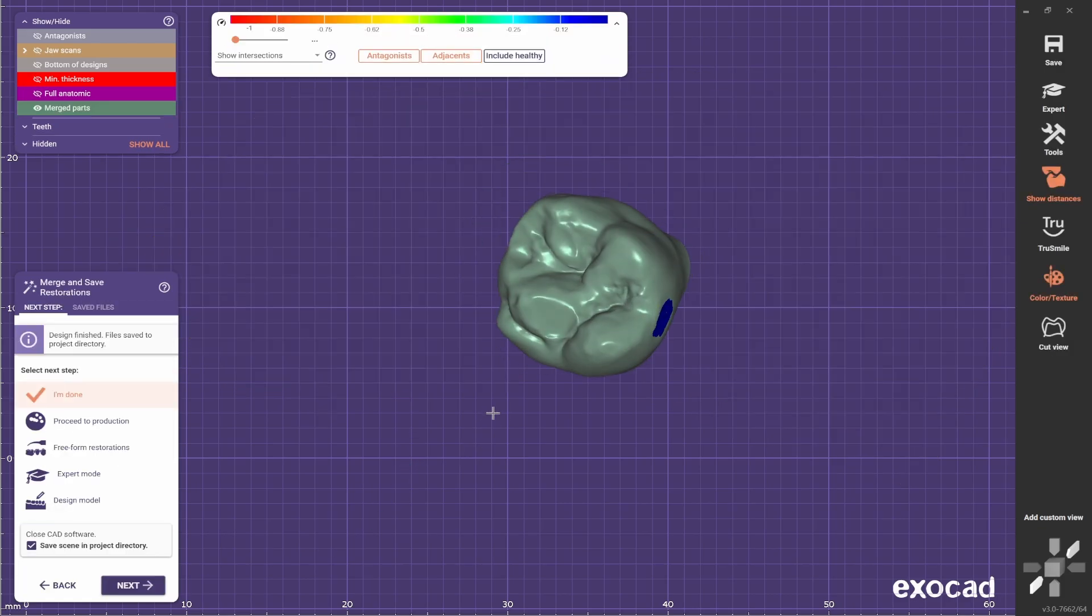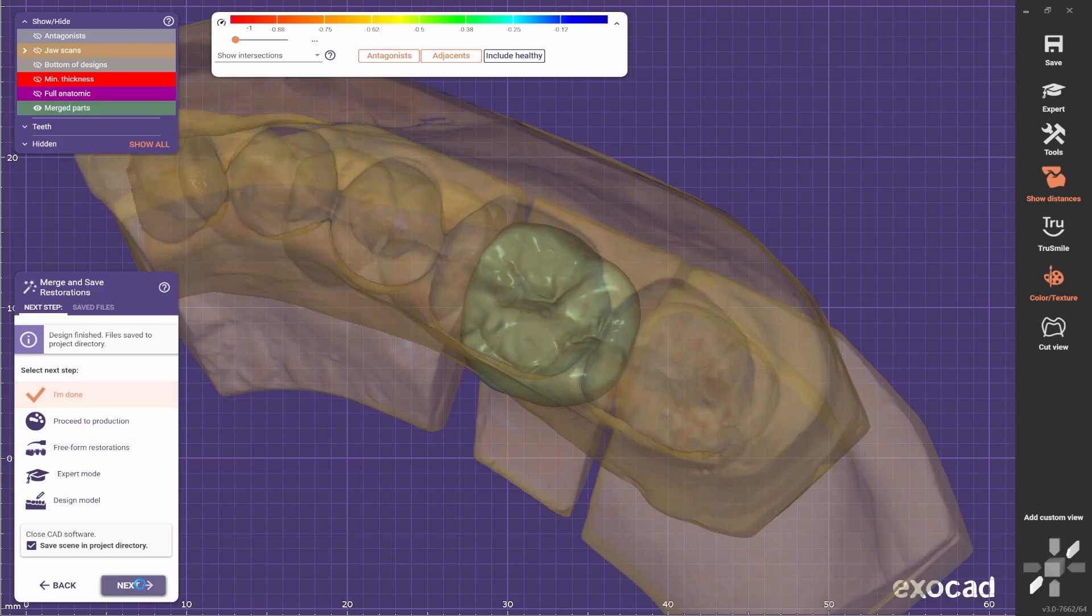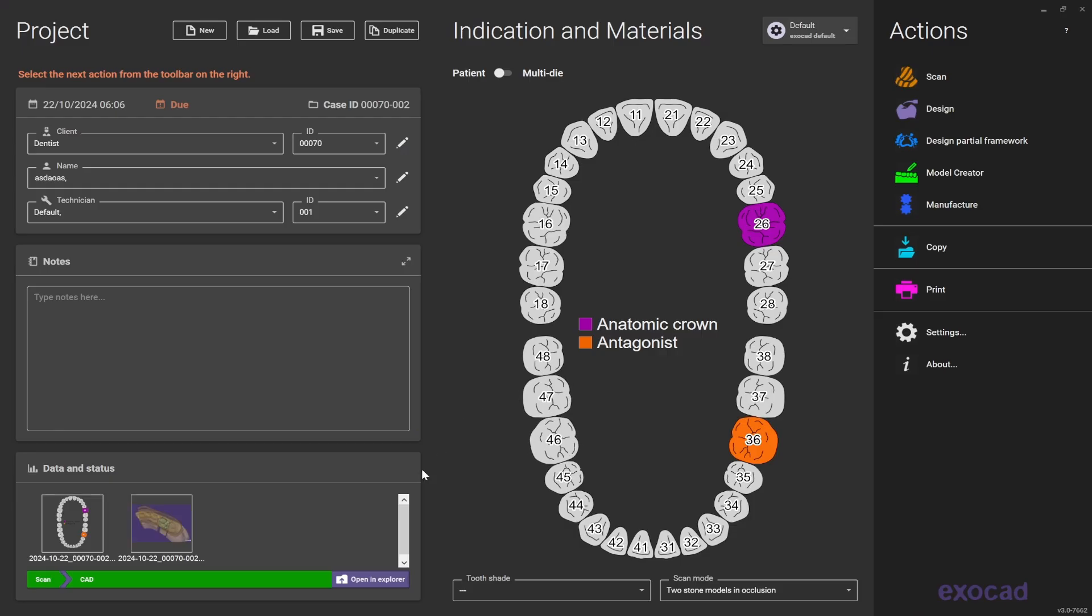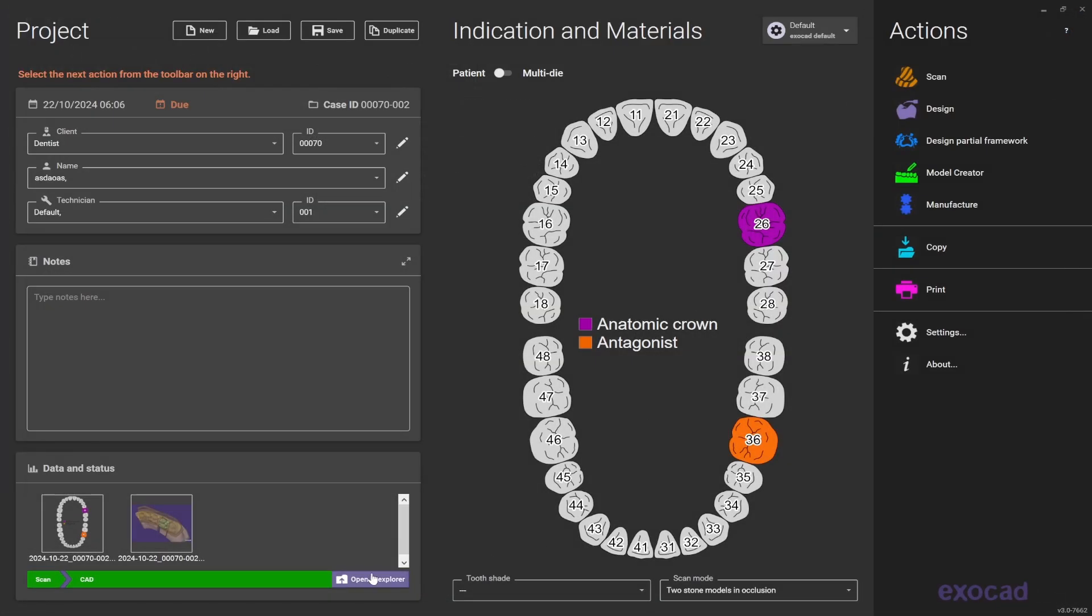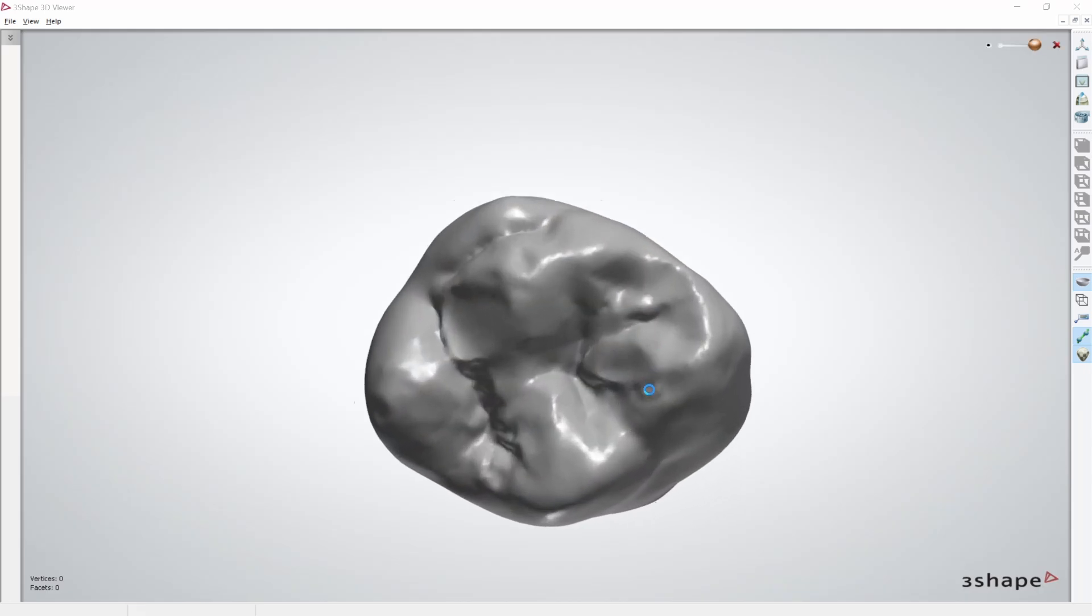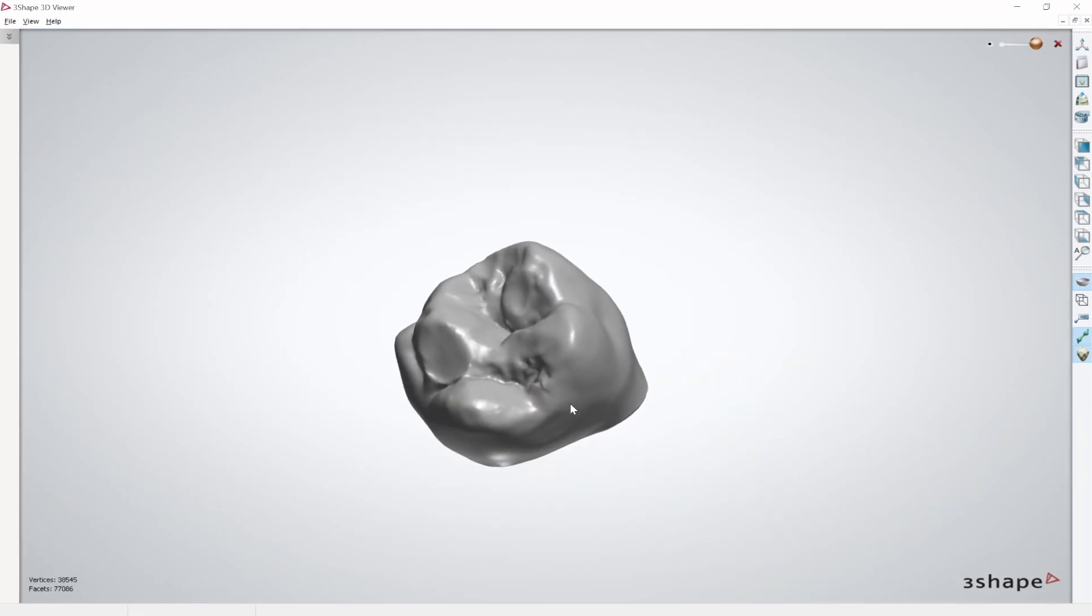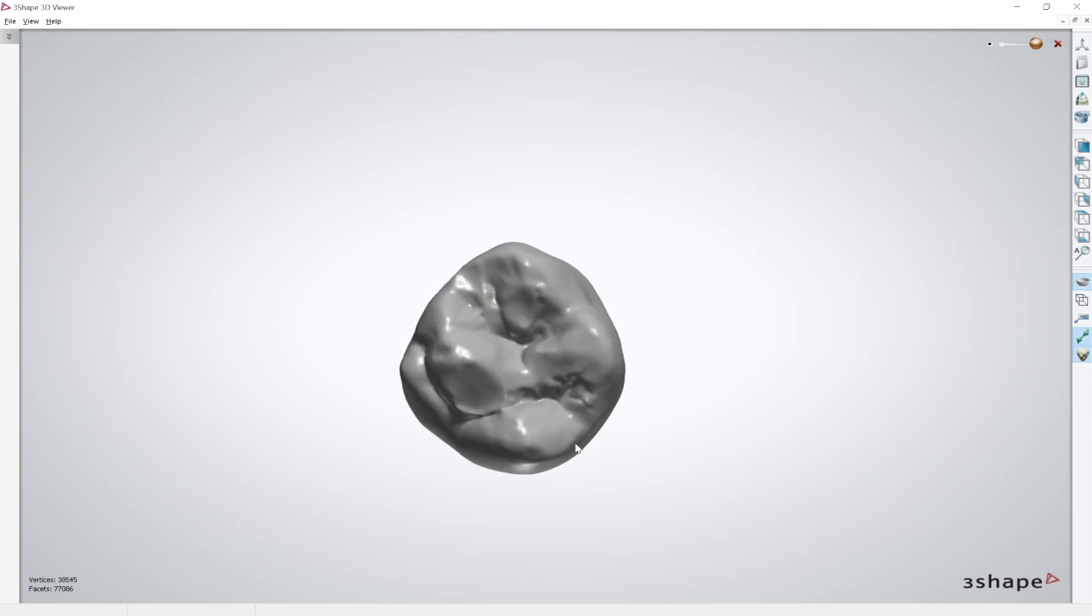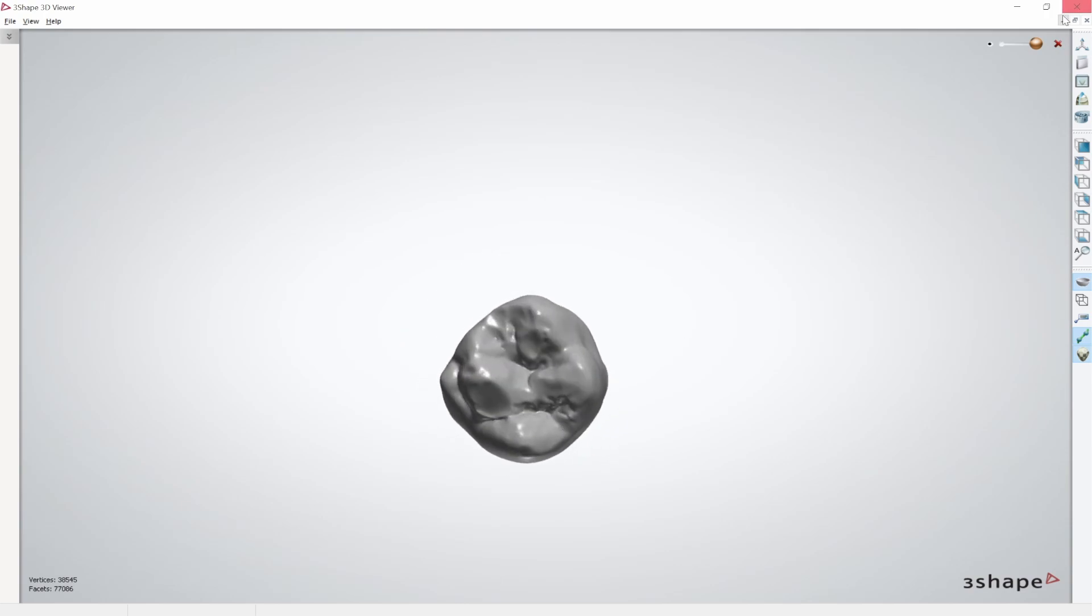If everything is okay, say I'm done and go next. Now to get access to the core file of the design, just come here, open in Explorer, and this will be the file where the crown is. There you have it, a single posterior crown on ExoCad.